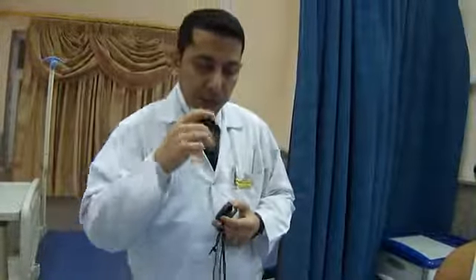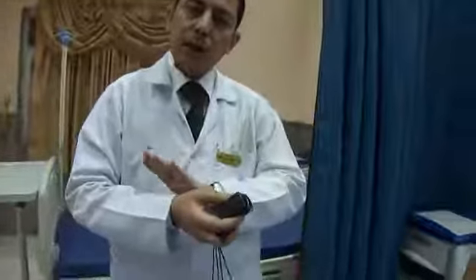We have additional 3 issues the candidates should know about. The first is a patient with methemoglobinemia. The pulse oximeter will be falsely lower than normal. It detects the oxygen saturation at about 85 percent, which is not wrong, while the arterial oxygen tension will be normal.